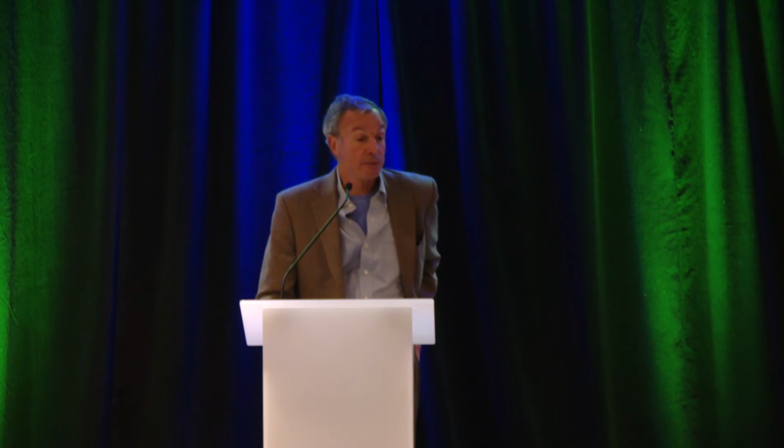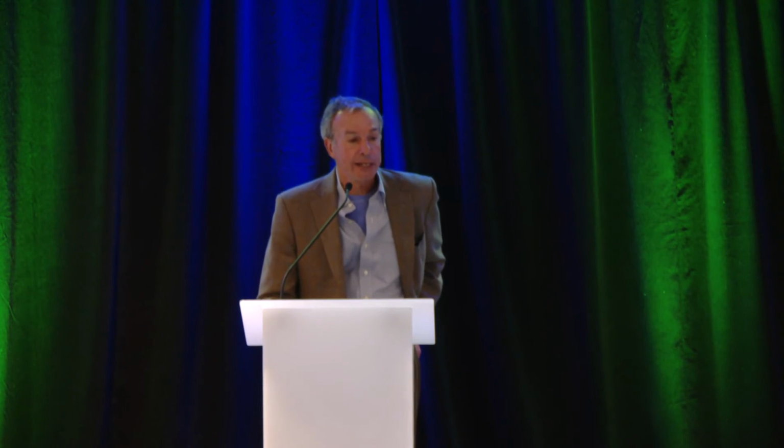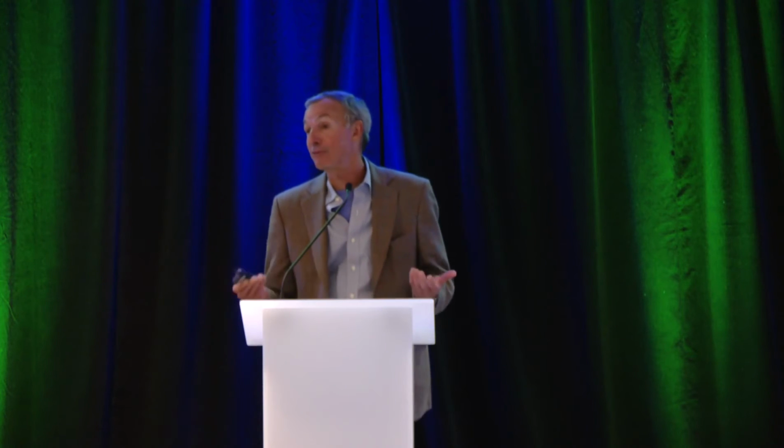And then the world changed, and key to that change was Ray Clouse, who basically brought us into high-resolution manometry. Ray, I was a huge fan and a good friend of Ray's. He died prematurely some years ago, but this is kind of what Ray did: he thought that, well, 8 might be good, but 36 is probably better. And then when you get all of that, the whole concept of pressure topography came in, where you take all those line tracings and you transform them into pressure topography by interpolating between each recording site. And this is now familiar to everybody, but this was a huge revolution when this occurred, whatever it was now, 15 years ago.